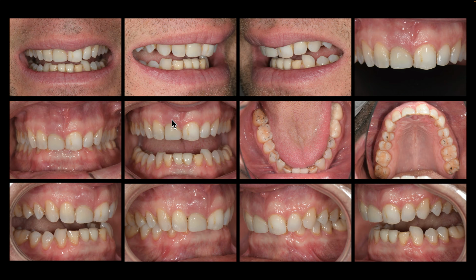So I ended up having to do a crown and bridge impression on the implant abutments that are, again, one piece attached to the implants. Not a really good system, but we managed to make it work. We'll talk about that a little bit.